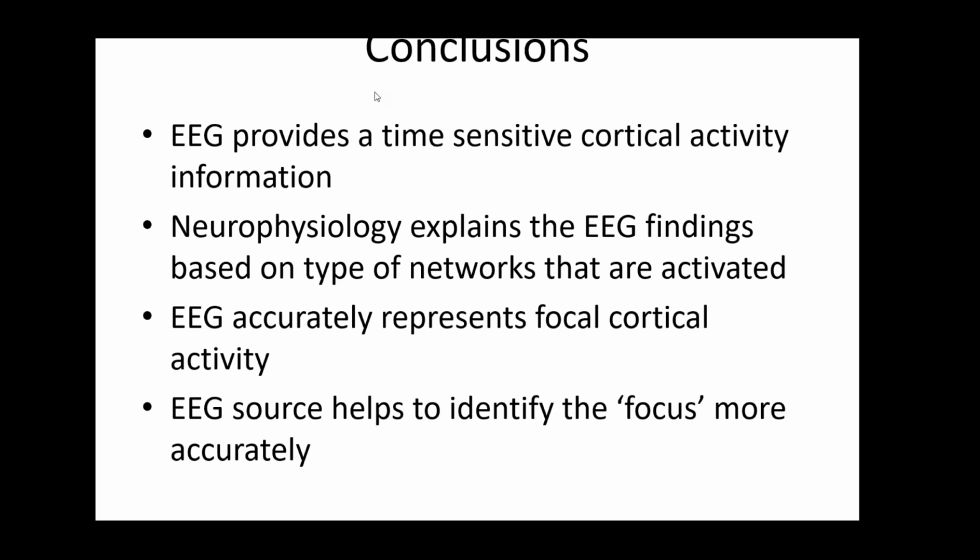The lateral inhibitory networks in the cortical network are going to be dormant. That would allow the epilepsy focus to be more active and allow this spike to be present. And you can see a higher synchronization because the EEG in sleep is more synchronized.